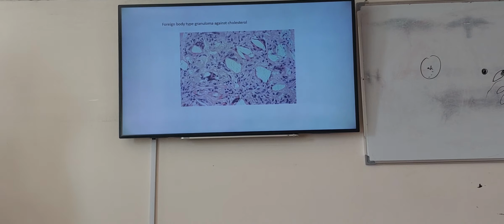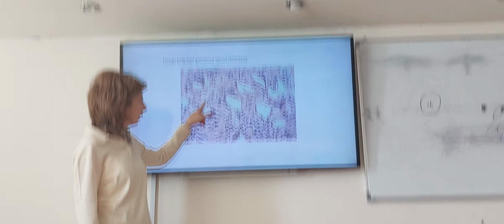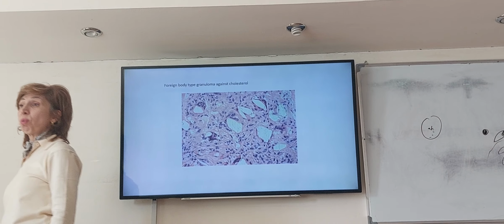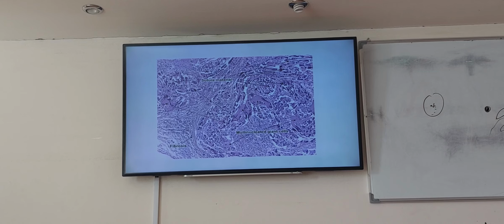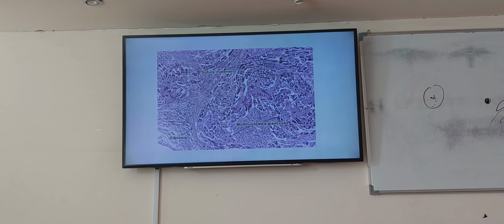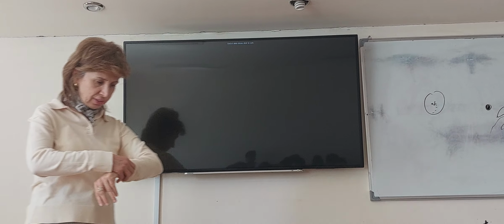Okay, this is a picture, close. You see multinucleated cells, and these are bubbly cytoplasm, they are foam cells. This is suture material, that's what I said in hypertrophic scars. And finish. Now I will come to the theory, the last part.